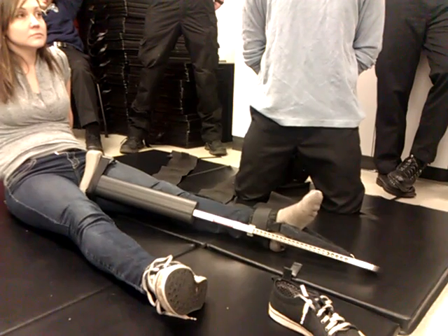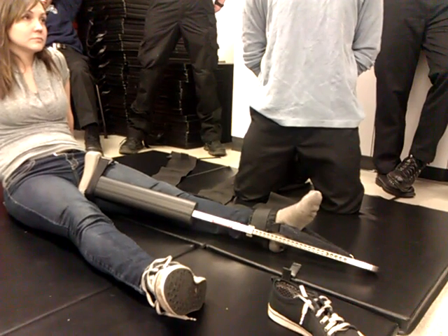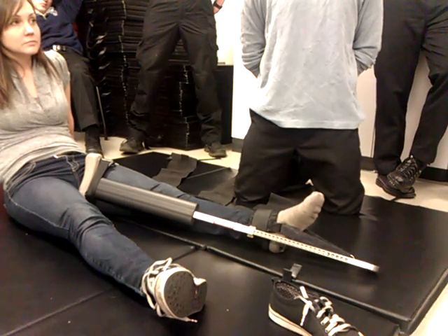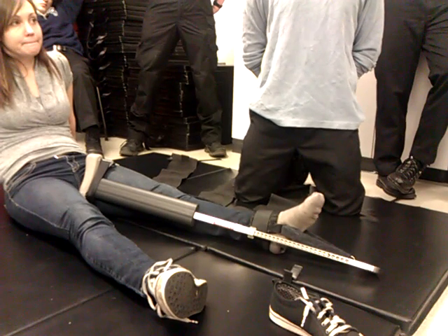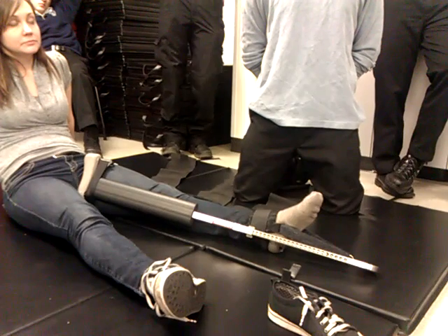ask the proctor, am I going to pull traction? And if she says yes, you need to pull traction, and you cannot lose traction at any point during the station. Okay? Which means that if you pull 15 and you end up with a result of 13 or 12, then you're done. Okay? So you have to be prepared for this.